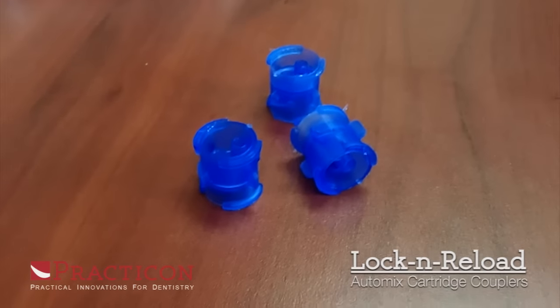My friend David's here to tell you how it works. Like many clinicians, you probably have the problem of not knowing what to do with the leftover material in your VPS cartridges. The Lock and Reload is here to solve that problem.